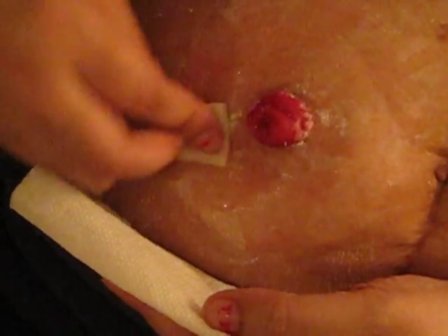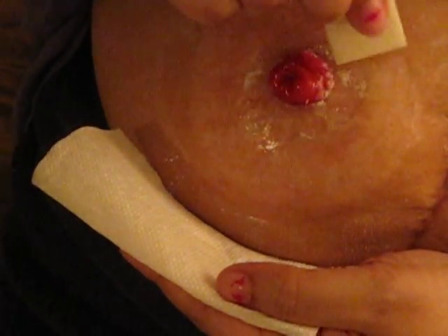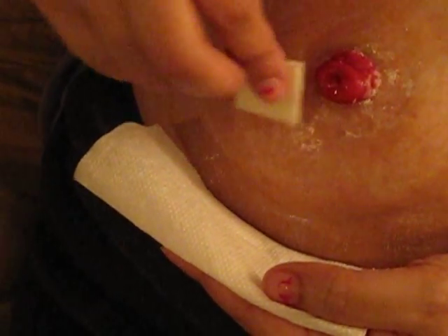But you want to really get that covered. And then I make sure I go all the way to the edge. Without this barrier wipe, it really itches me because there's nothing between me and that adhesive.